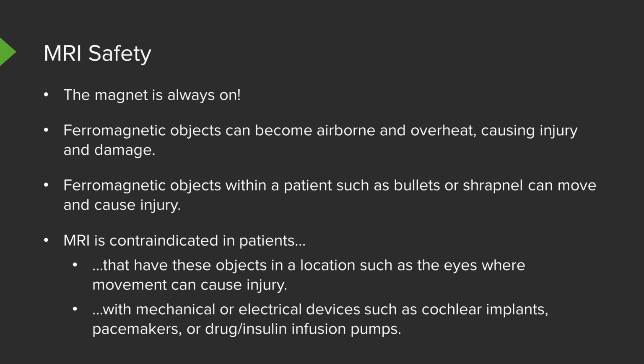I've actually heard of a case report where the cleaning person went into the MRI machine not realizing that this was an MRI machine, and the entire cart got blown up and ended up within the MRI scanner, destroying both the cart and the scanner. So it's very important to keep this in mind.